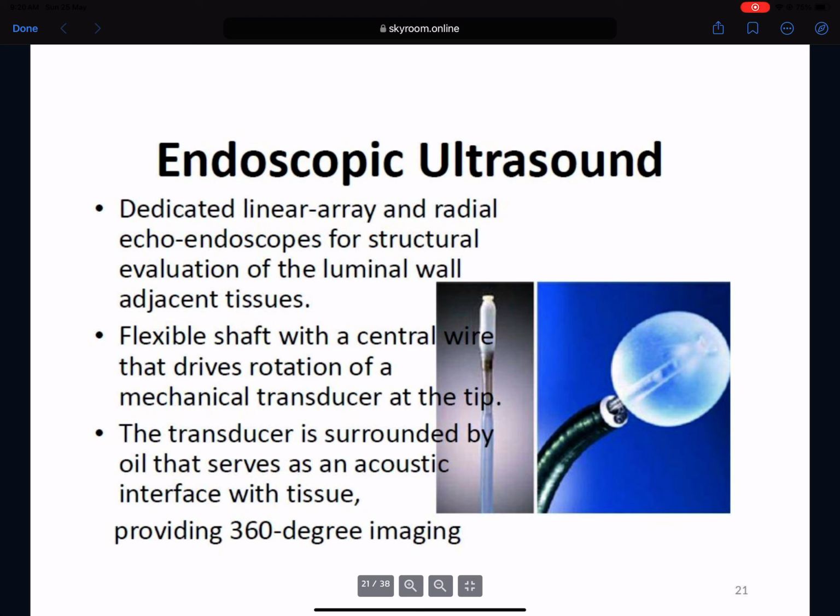You can see the first wall of the stomach, but inside the stomach you probably have some gases from digestion, or some air, so there is no reflection, excuse me, there is no ultrasound passing through inside the stomach.